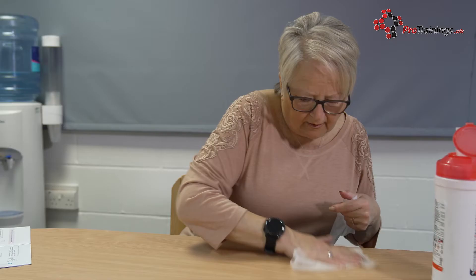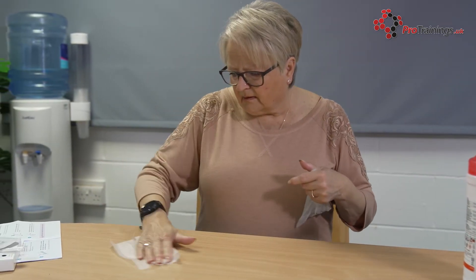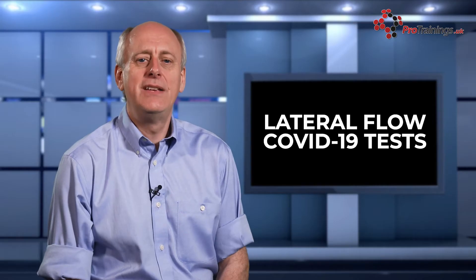First, prepare the test by reading the instructions carefully. Clean and dry a flat surface where you are placing the test. Wash your hands thoroughly for 20 seconds with soap and water, or use hand sanitiser to avoid contaminating the test, and dry your hands. If doing more than one test, wash between tests.